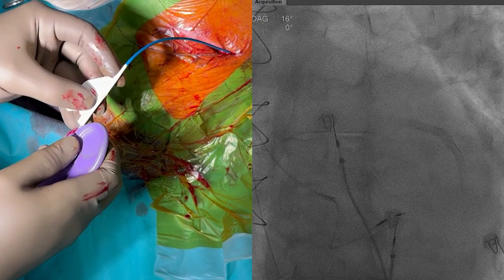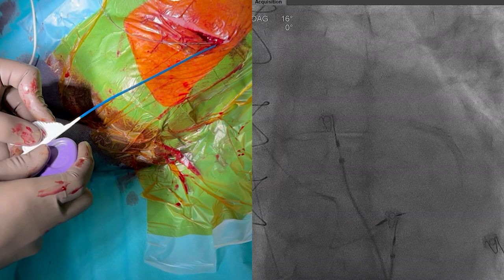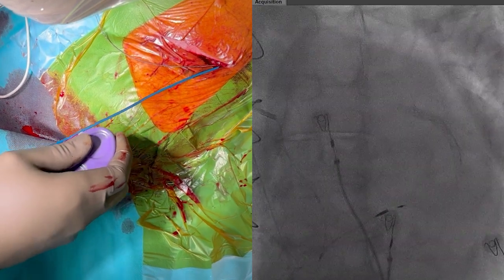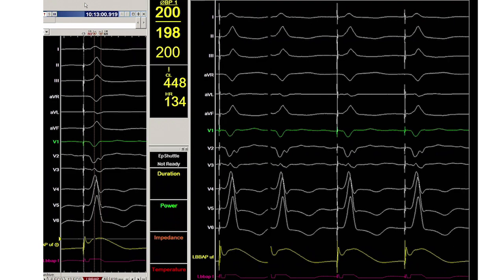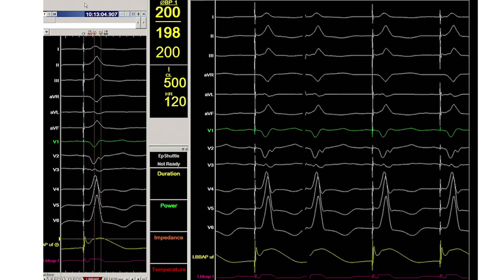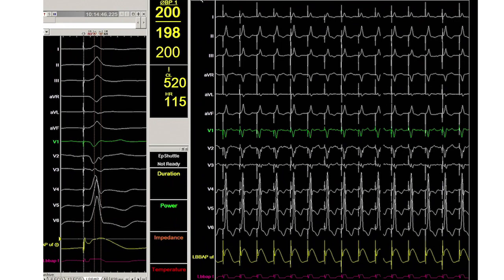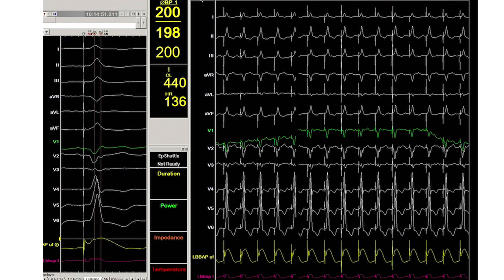Now back to the first case, where we will remove the guiding catheter using a slitting tool under fluoroscopic guidance. Lead displacement is rare as the helix is screwed deep within the septum. After removing the guiding catheter, the lead needs again to be tested. While we see a monophasic and short R wave in V6 and R prime wave in lead V1, the result is less striking than in the second case.